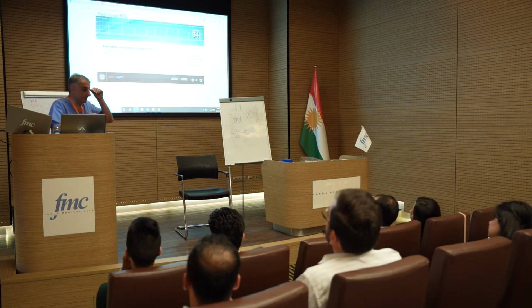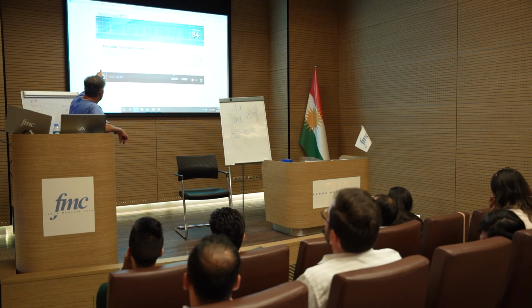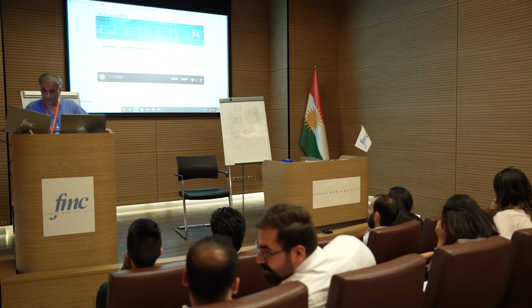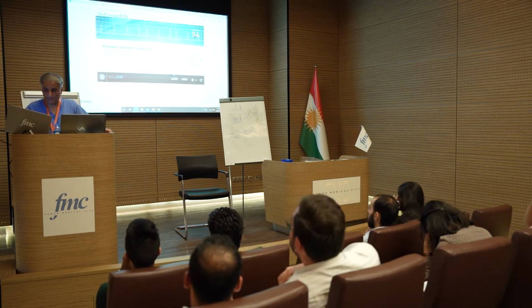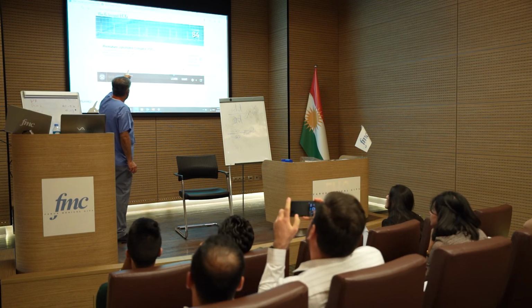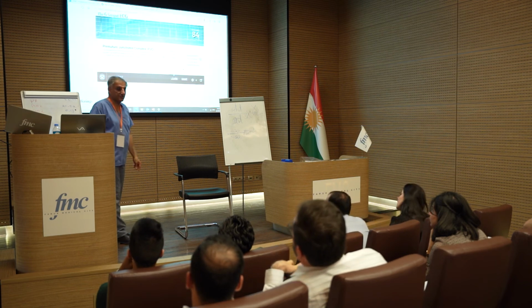So this is sinus rhythm with junctional ectopics. There's a P wave there, a P wave there, but then suddenly one comes without a P wave, then a P wave again, and then one that's junctional basically.